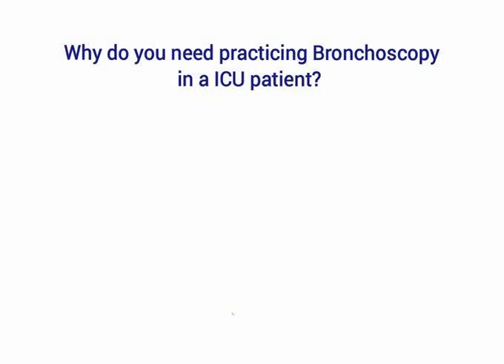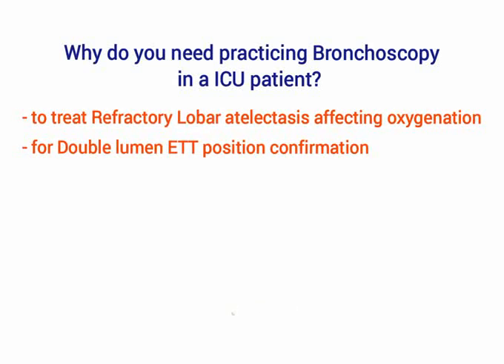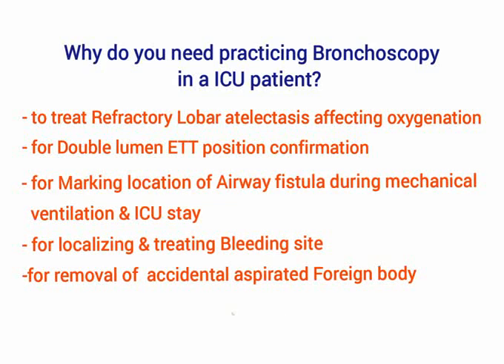So the reasons for bronchoscopy in the ICU include: to treat refractory lobar atelectasis affecting oxygenation, for double lumen endotracheal tube position confirmation, for marking the location of an airway fistula during mechanical ventilation and ICU stay, and also for localizing and treating a bleeding site, and for removal of an accidentally aspirated foreign body.